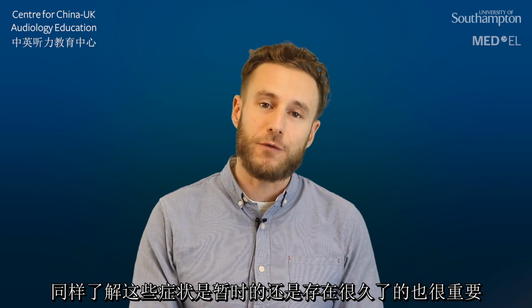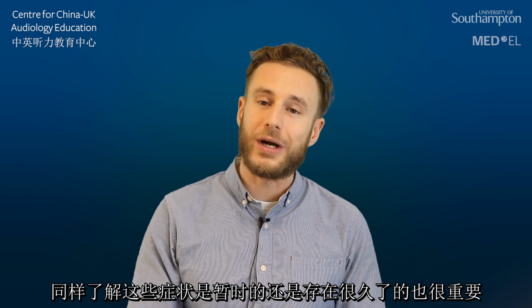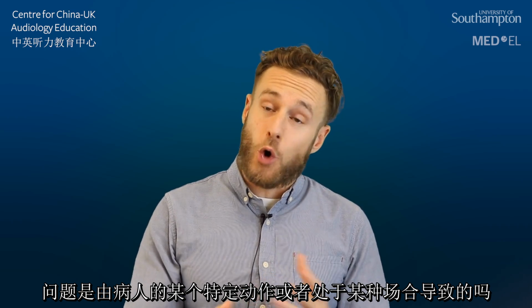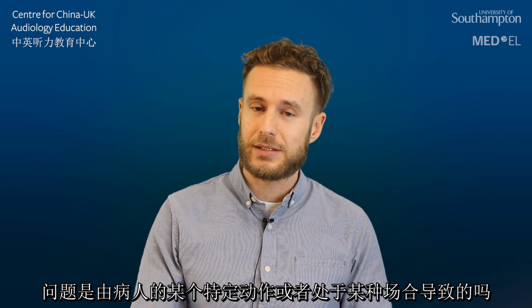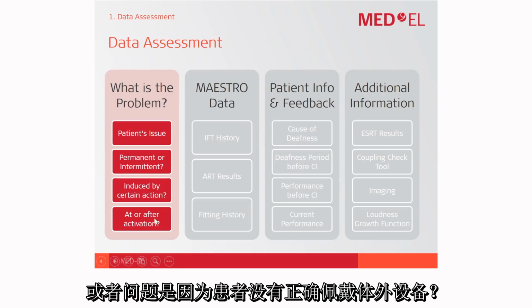It's also helpful to know if the problem occurs permanently or intermittently. Is it caused by a specific action or when the patient is at a specific place? So is it at home or only at work or school? Or is it occurring only when the processor is used, or also when the patient is not wearing the device?